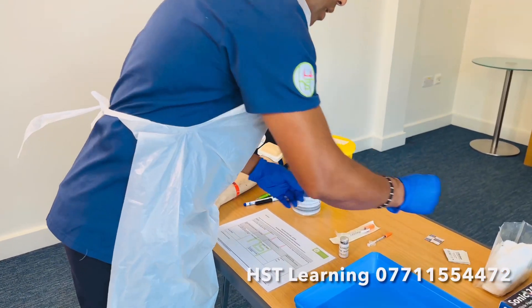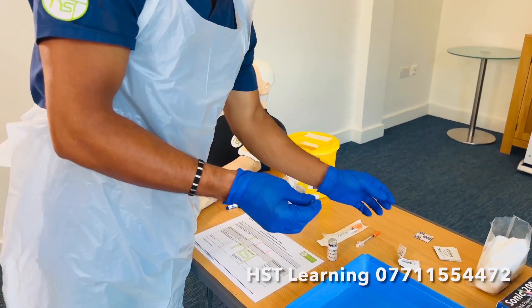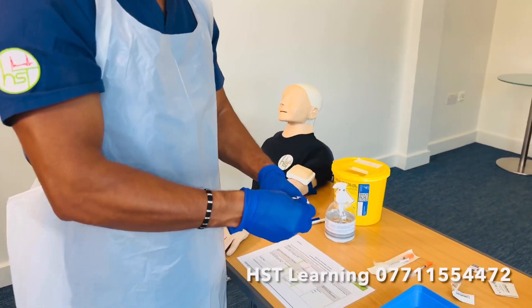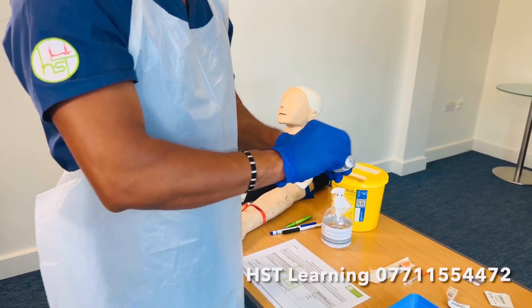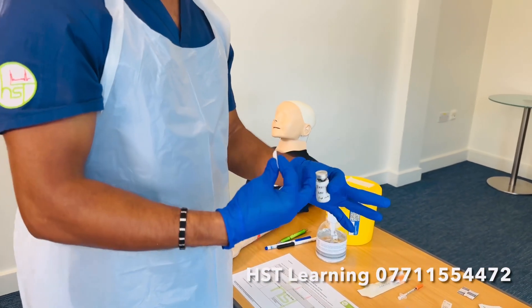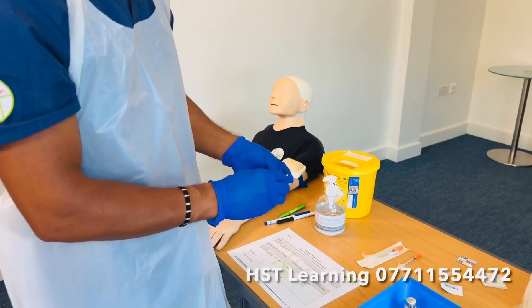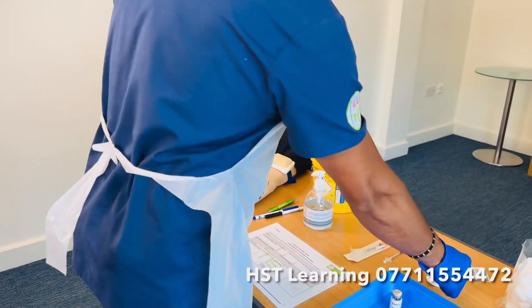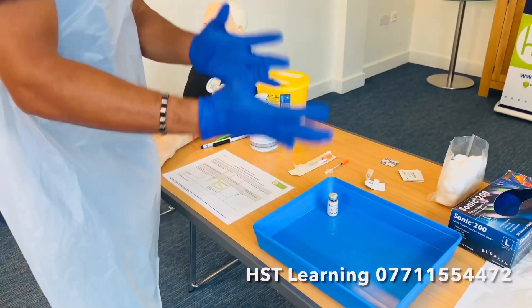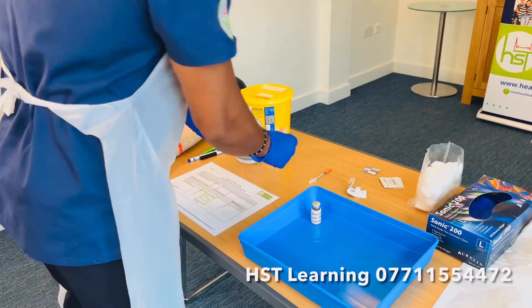Once you've done that, you need to clean the medication. I'm going to use the chlorhexidine wipe — clean the medication for 30 seconds, then allow it to dry for 30 seconds. Place it into the tray; you can discard it into the yellow bin if it's closer, or leave it there and throw it at the end.